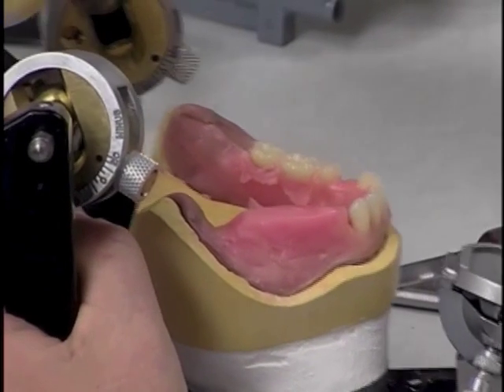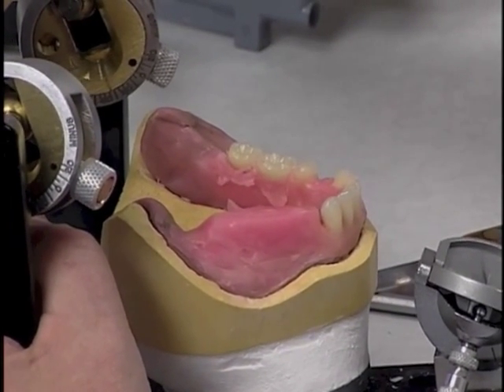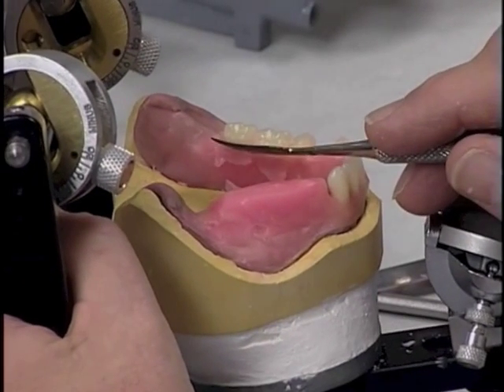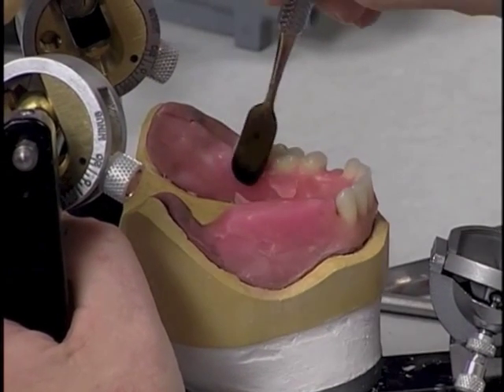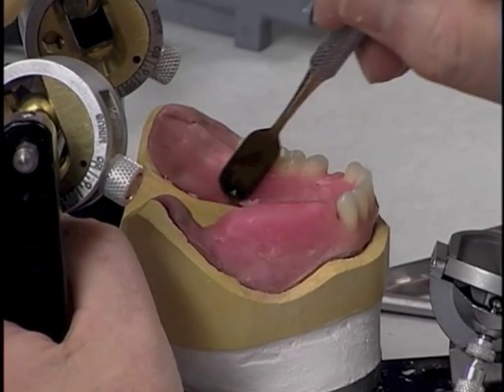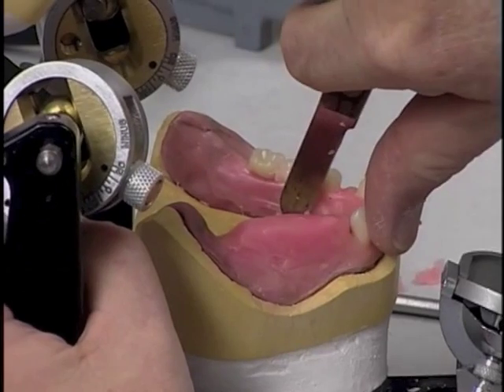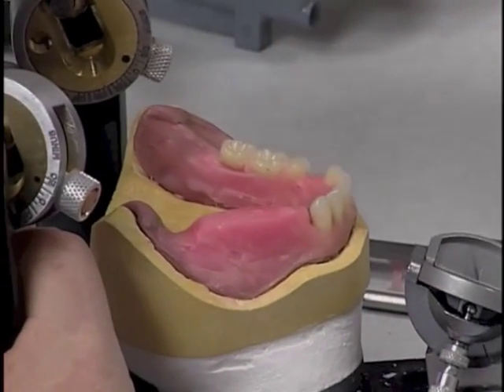On the lingual, we need to stabilize it because we have a little space between that second molar and the wax, so we want to flow wax into that so that the tooth is held nicely in place with the wax after the wax is hardened. That's doing pretty good now. We have a little excess wax here on the lingual, which we can get rid of, and just smooth the wax out.